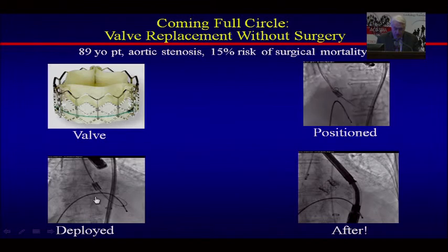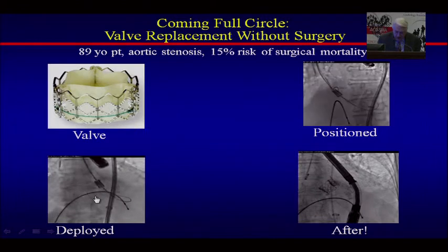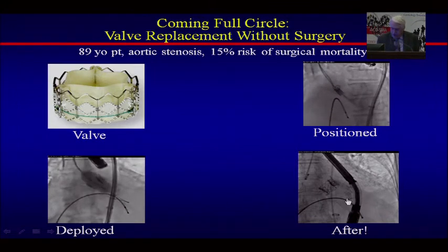And what I want you to watch is, first you'll see the heart beating at a normal rate, and then you'll see pacing-induced heart rate of about 180, sufficient to drop the arterial pressure to around 60 to 70 millimeters. And when that happens, the balloon within the valve is then inflated. So let's watch. Normal heartbeat, and you'll see now there's pacing, and now blood pressure drops, balloon inflated, balloon deflated, and there is the valve now in position. That whole procedure took less than 10 seconds typically.